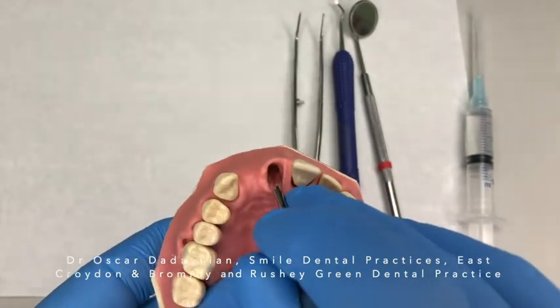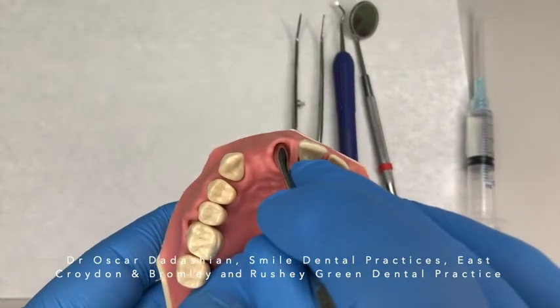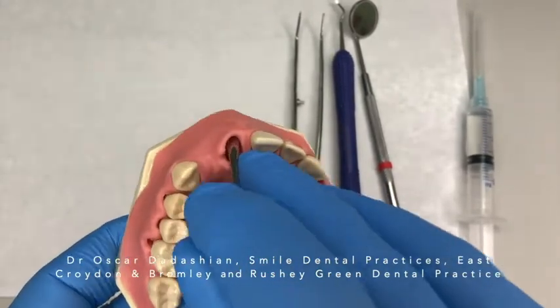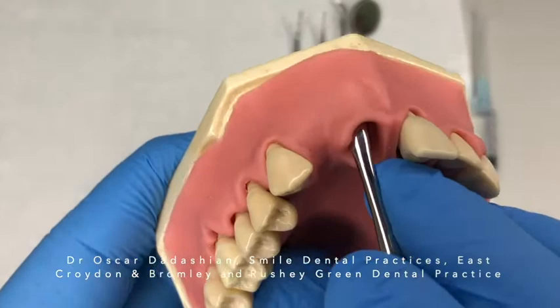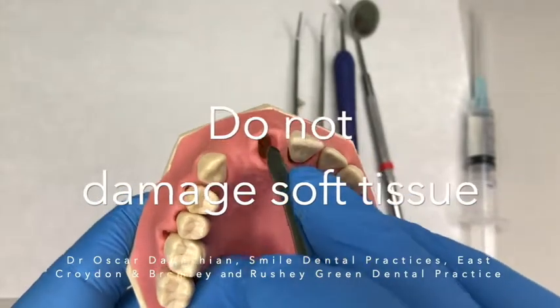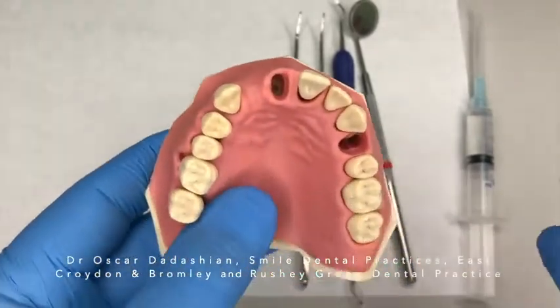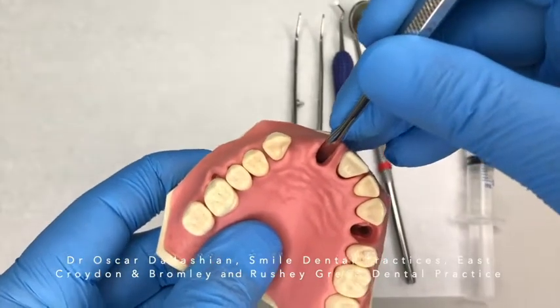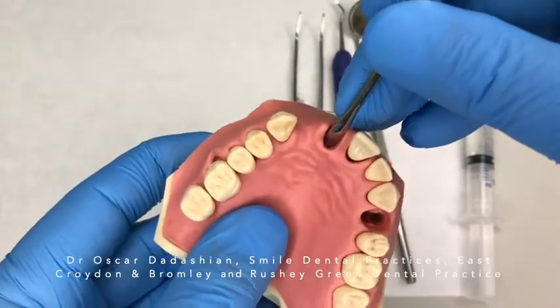Again, go to the bottom of the cavity, gently follow that bony wall, come to the crest, and then go beyond that crest to gently create that pocket between the bone and the soft tissue. You can see how the soft tissue is now mobile and moving away from the bone. Be careful not to push your mucoperiosteal elevator through the gum — do this very softly and gently without damaging the soft tissue. Perform this procedure on the palatal surface as well, undermining a pocket both buccally and palatally of the extraction socket.